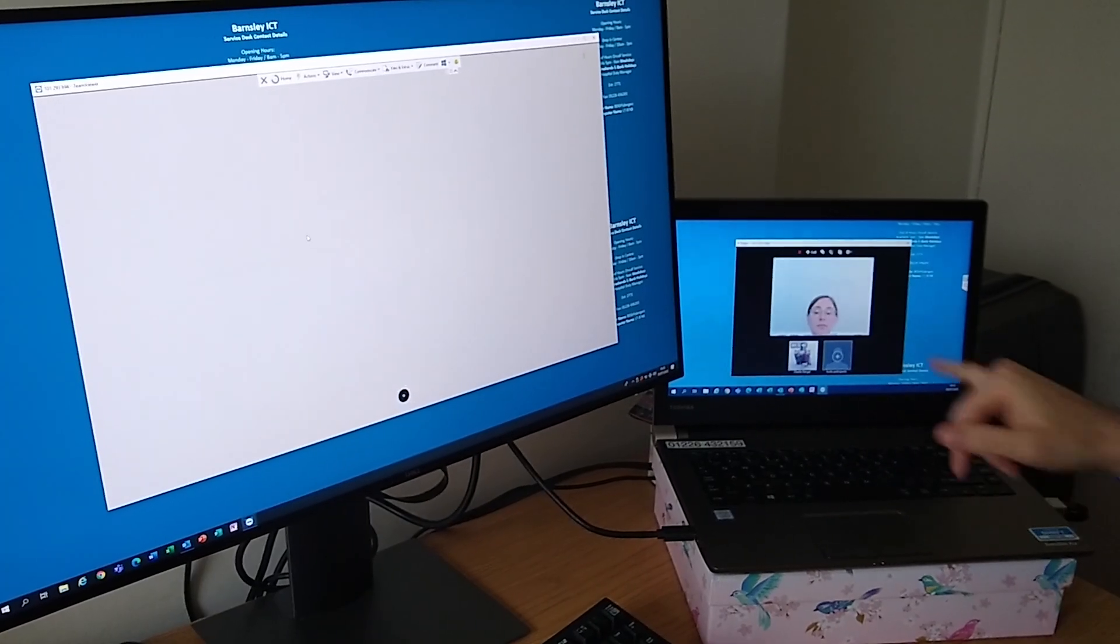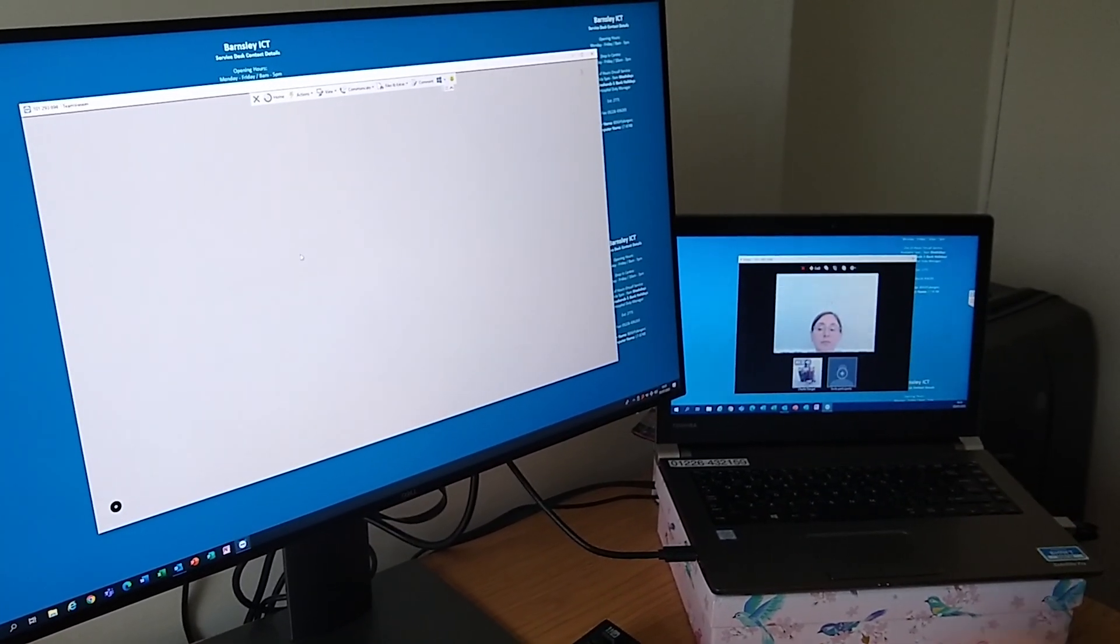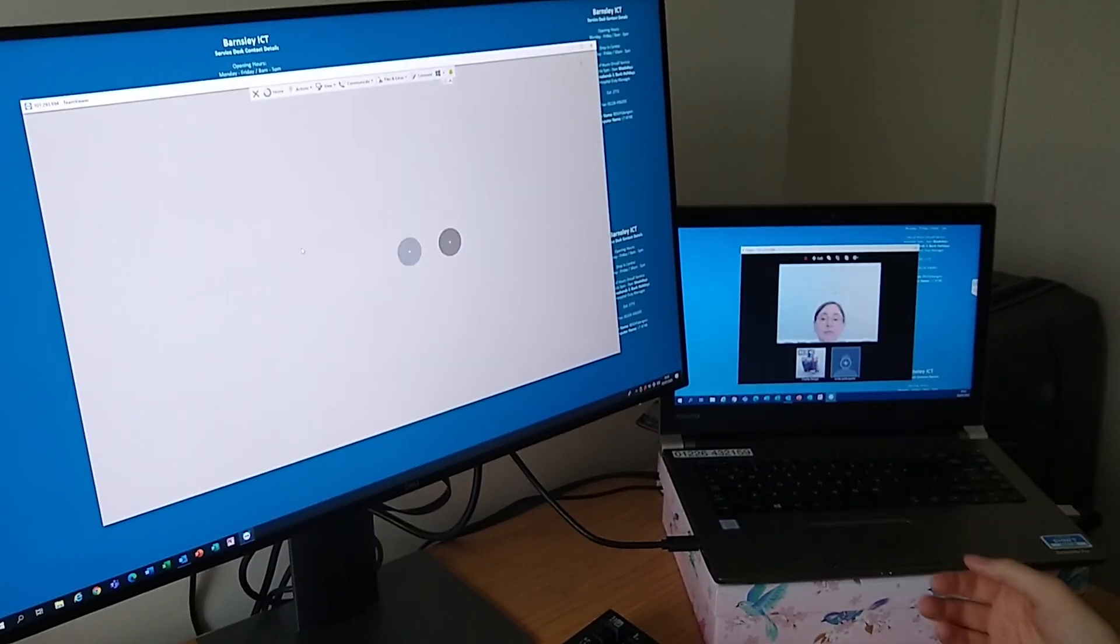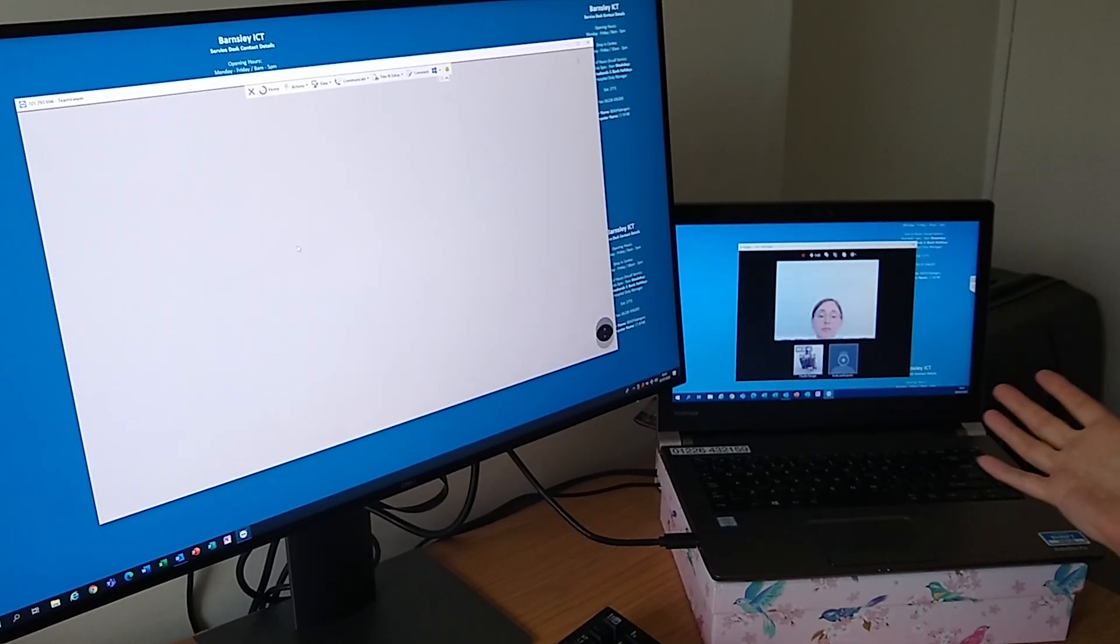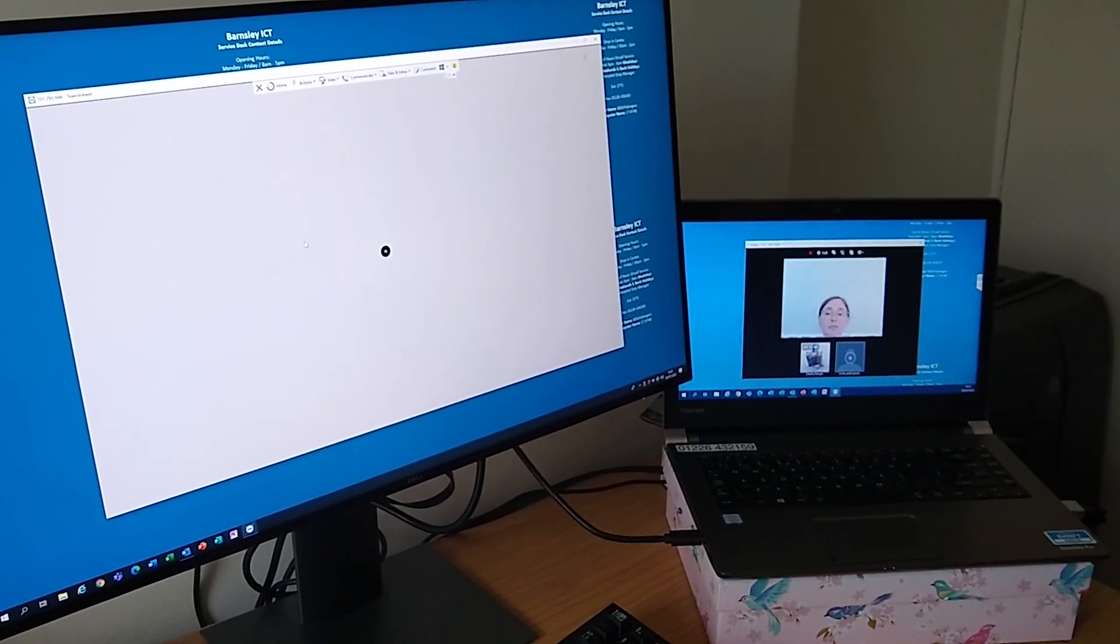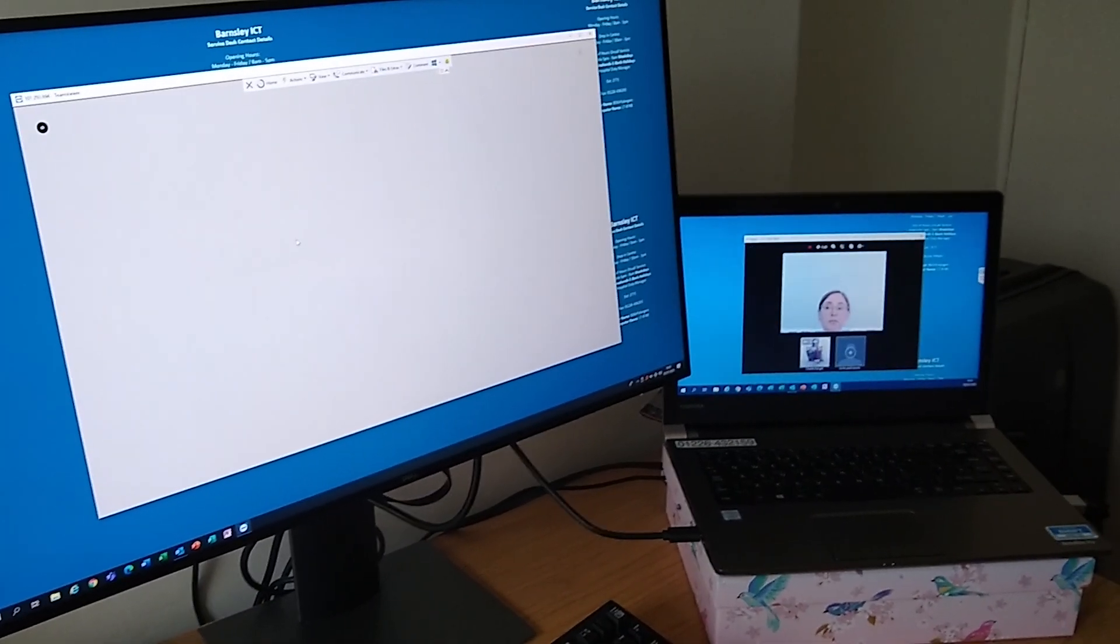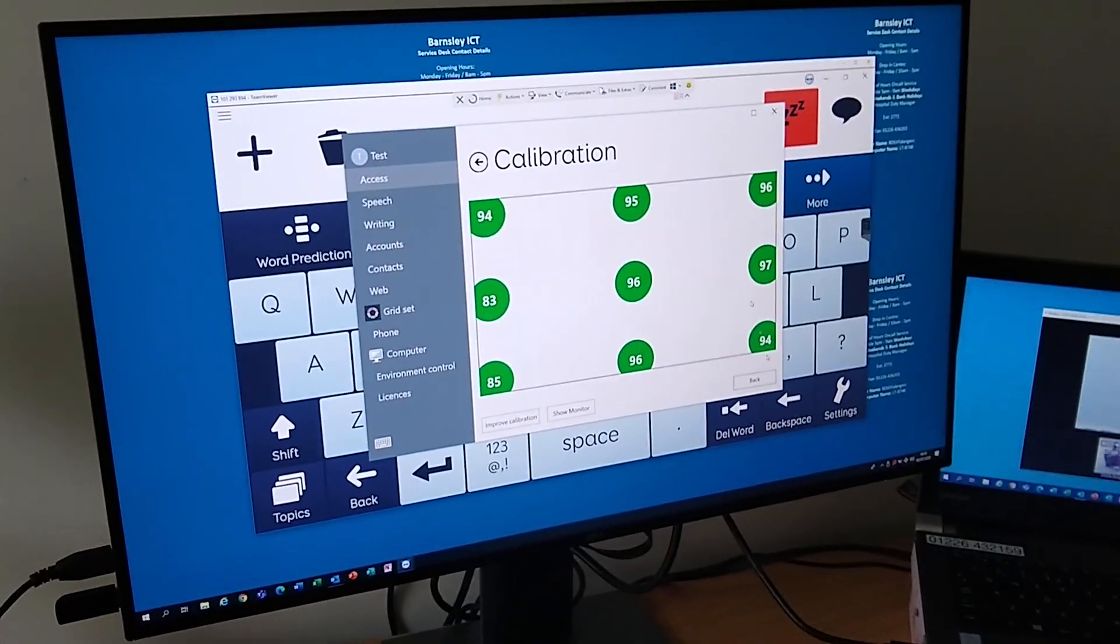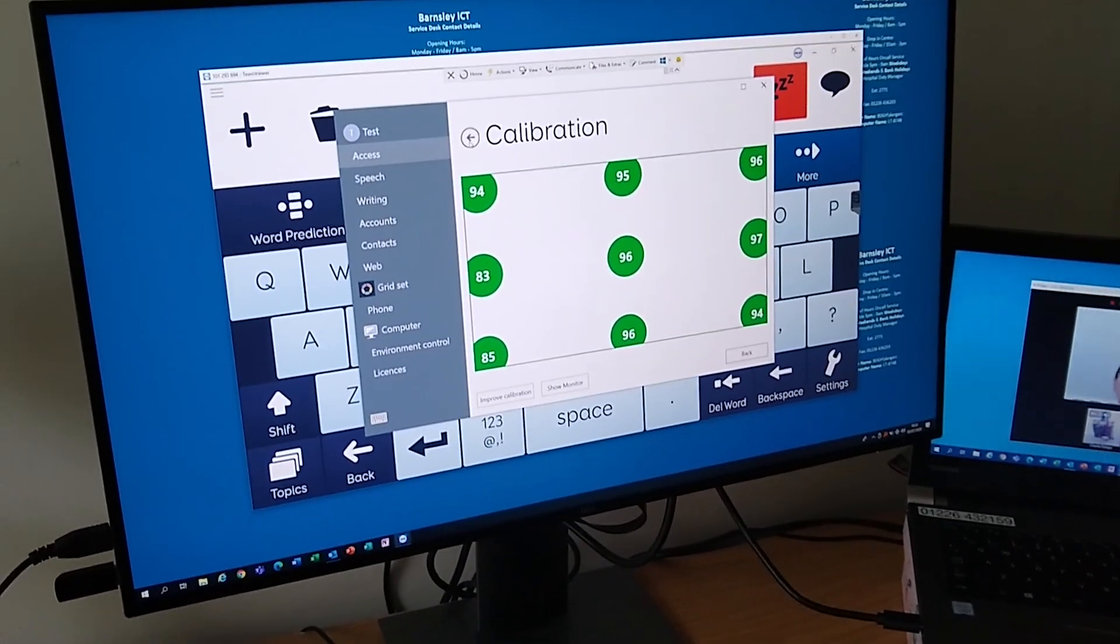I can just about see her eye movements and also can keep an eye out for any other reflections, like if somebody walks behind and appears in. I can also see if Alison's moving her head a lot, because some people try and use their head to use eye gaze which sometimes isn't very helpful. We've come to an end, so you've done very well there. You've got a good score.